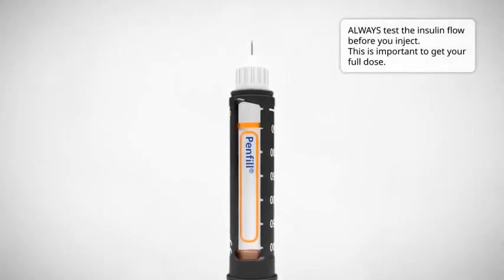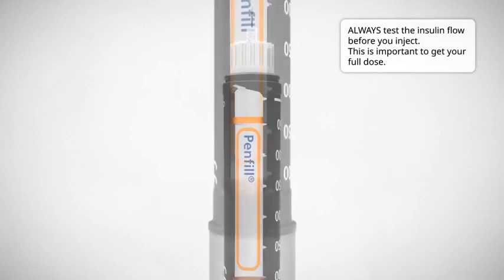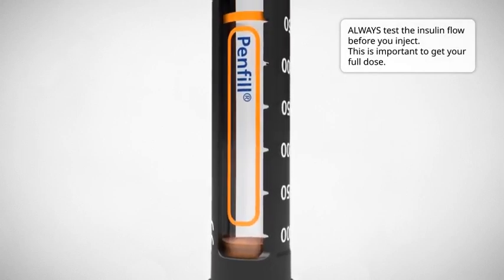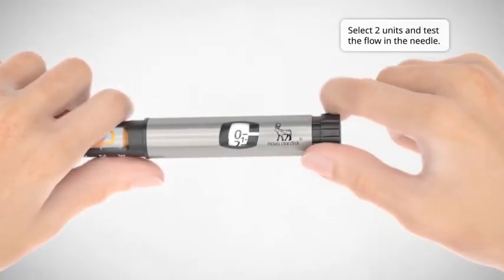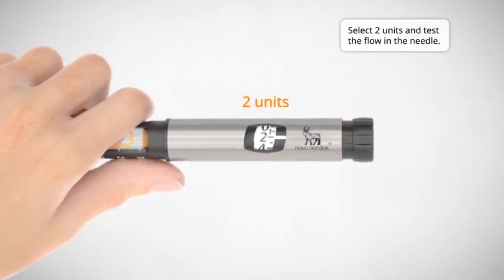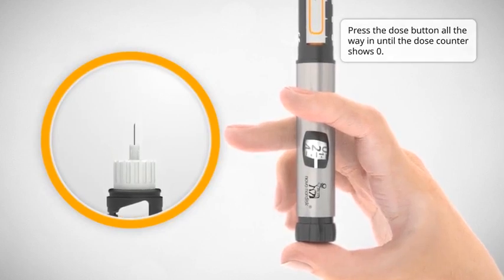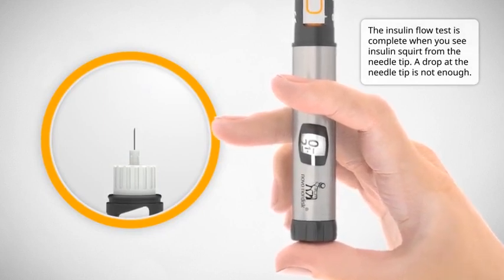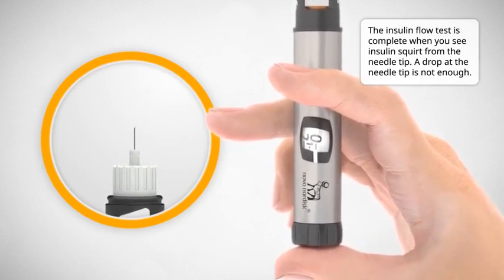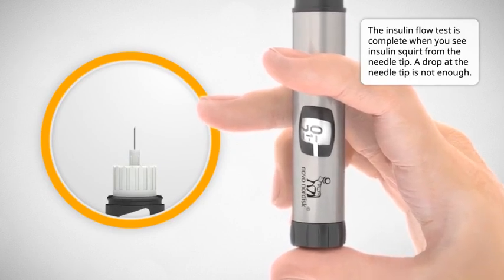Always test the insulin flow before you inject. This makes sure that any gap and air bubbles are removed and that insulin is getting through the needle. If you do not test the insulin flow, you may get too little insulin or no insulin at all. To test the insulin flow, pull out the dose button and turn it to select 2 units. Press the dose button all the way in until the dose counter shows 0, and make sure insulin squirts from the tip of the needle. Repeat this procedure if insulin does not appear. The insulin flow test is complete when you see insulin squirt from the needle tip. A drop at the needle tip is not enough.